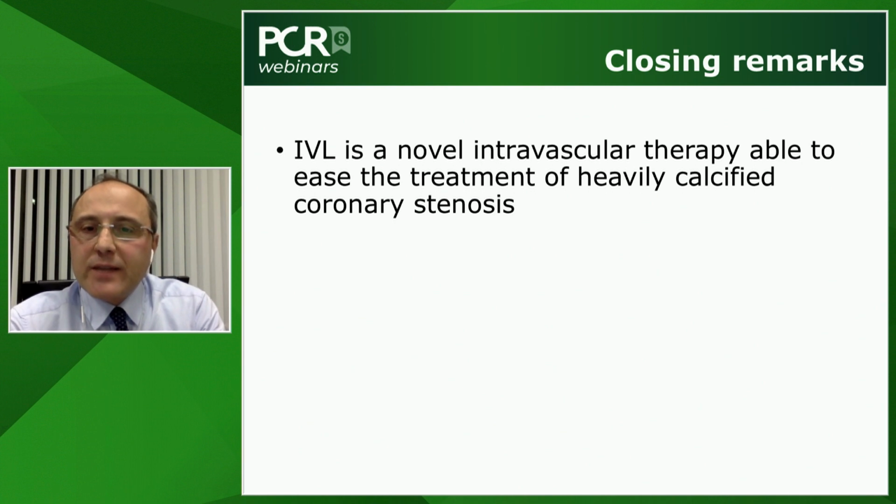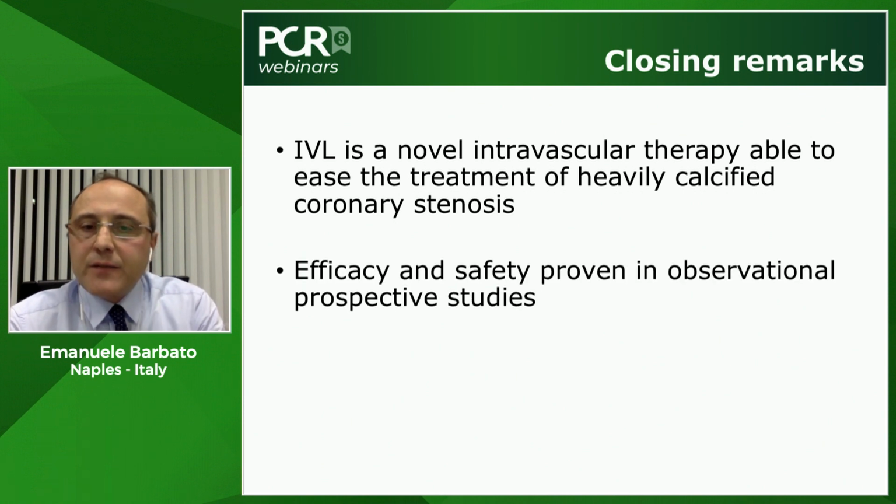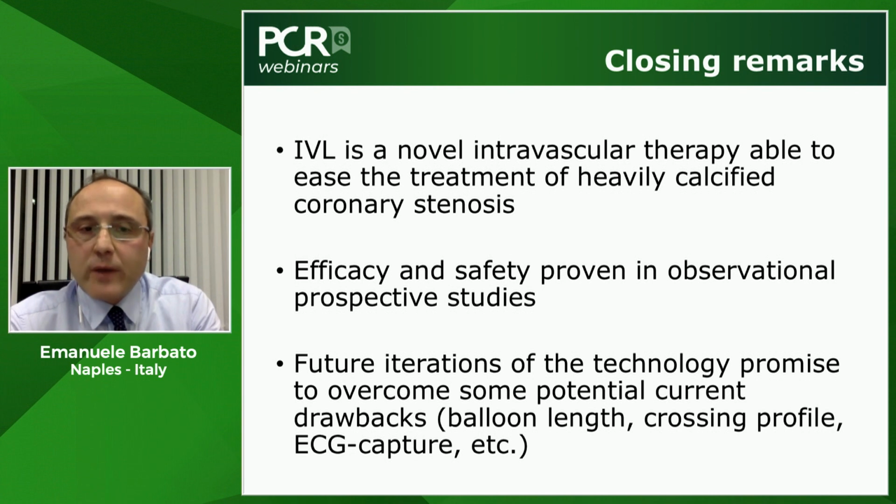So intravascular lithotripsy is a novel intravascular therapy able to ease the treatment of heavily calcified coronary stenosis. The efficacy and safety has been proven so far in observational prospective studies. We have seen and discussed in this webinar the DISRUPT CAD III, but there are two other observational studies before that have shown the same kind of messages. We just learned from Michael that future iterations of the technology promise to overcome some potential current drawbacks. We heard of a longer balloon coming up, perhaps with better crossing profile, with the possibility to also deliver more pulses per treatment. That is also a feature that is most likely going to improve. And perhaps we are going to hear more about this ECG capture and a way to overcome it.